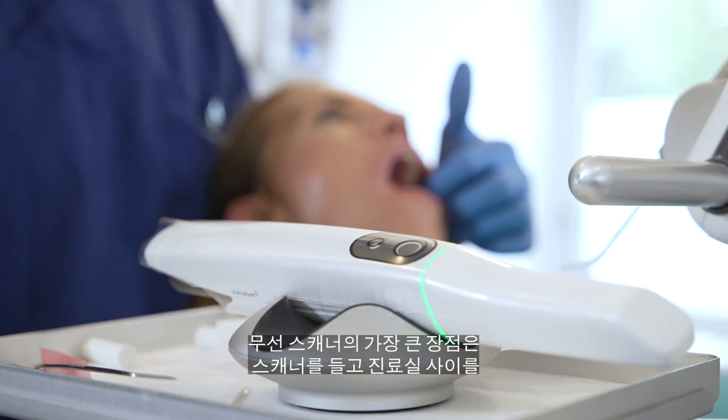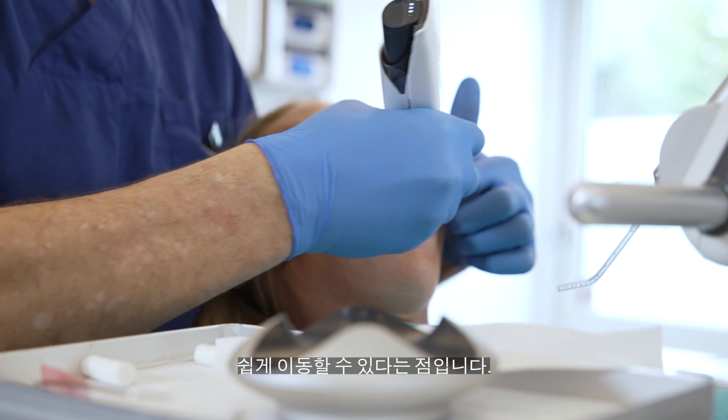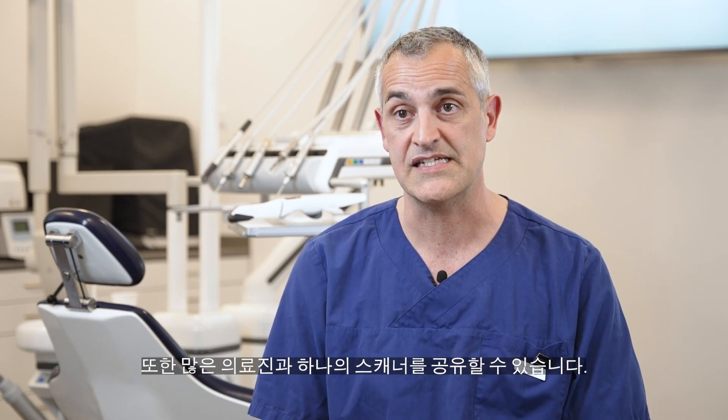The advantage of the wireless scanner is definitely that you can just move it from room to room, and you can definitely share one between a lot of dentists.